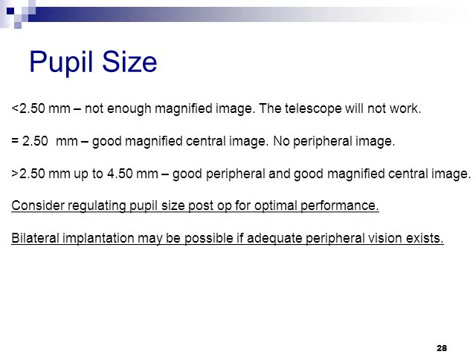When the pupil is between 2.5 and 4.5 millimeters, there is central magnified vision as well as peripheral vision. As the pupil enlarges further, the peripheral vision contrast increases, and at 4.5 millimeters, the central and the peripheral illumination are roughly equal. If the pupil is more than 4.5 millimeters, the patient experiences glare that will disturb his or her central vision.